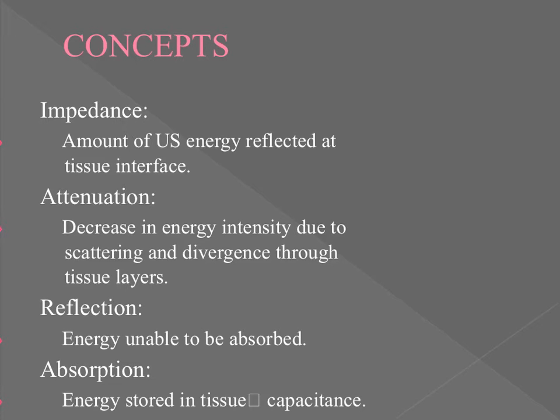Did you say hairy patients? Did you say not cleaning your patient's skin before applying therapeutic ultrasound? If you said any of those things, these are things that are going to increase impedance within our ultrasound treatment. So you're going to do whatever you can as a clinician to reduce the amount of impedance that will be experienced during an ultrasound treatment, right?